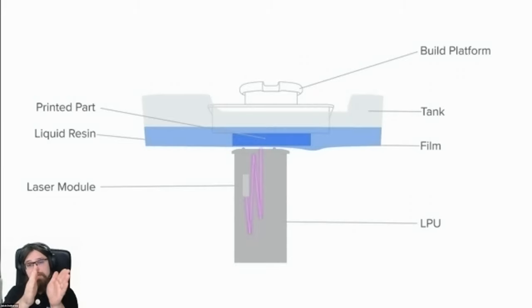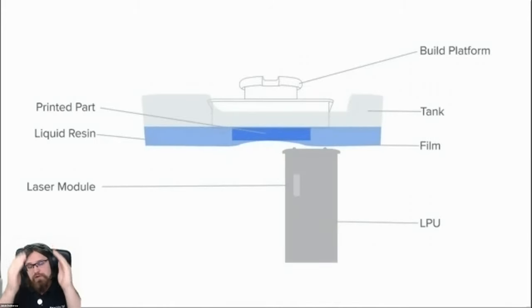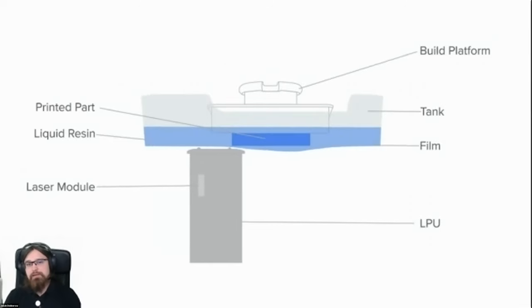And then when the LPU has moved all the way to the side, what will have happened is that we've cured the next layer of resin from the bottom onto our model. But now that we have cured it to the bottom, it also sticks to the bottom of the resin tank. So that's where we have to take it off again. We just bring the whole build platform up until it detaches from the bottom, and then it goes back down again. And as a little bit of a cycle, it goes like this.